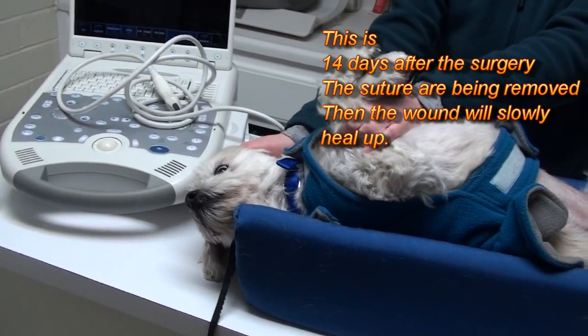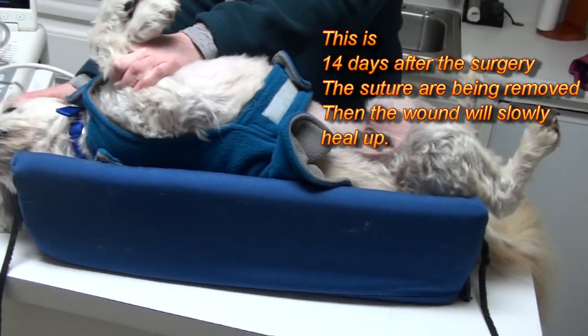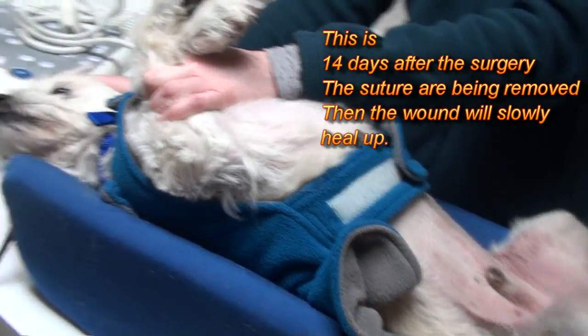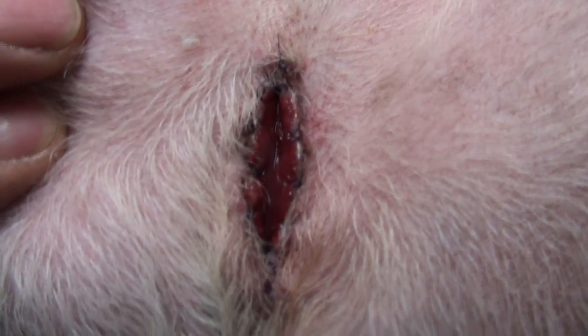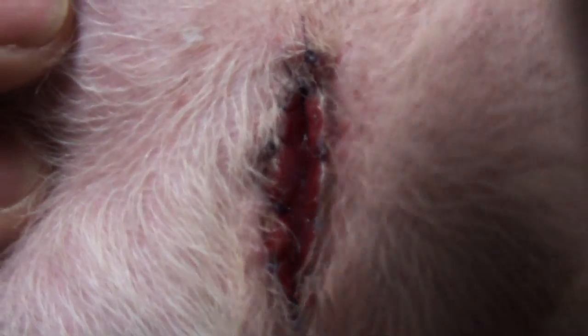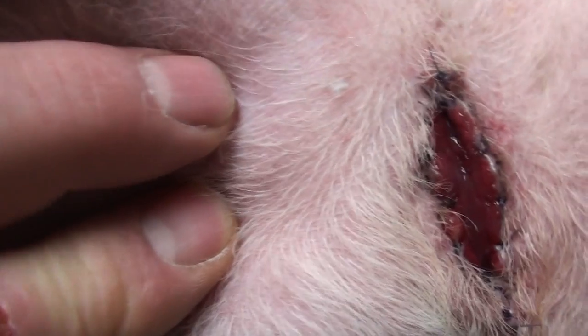Here's the stone under the screen of the microscope — you can see the big spikes. That's why they irritate the bladder and urethra. There's Bogey — he's laying on a little couch, so cute, with his little coat on because it's cold. I just want to show you, we're going to take the sutures out. That's what the incision looks like after a couple of weeks — it looks a bit rough, and you can see the sutures, but the wound will now granulate in.